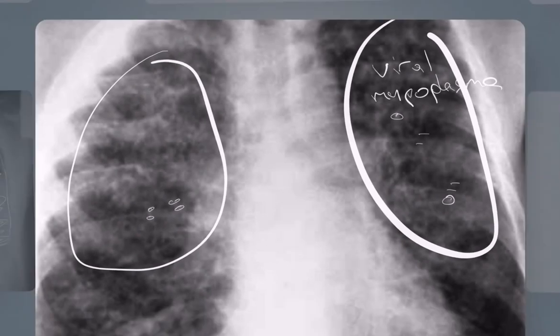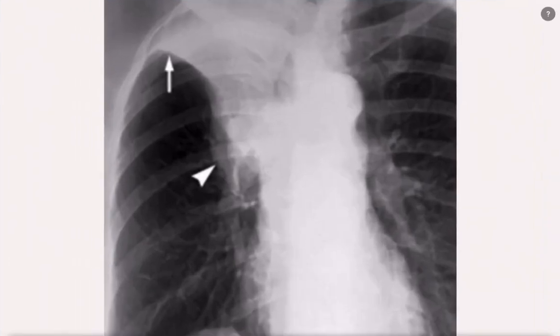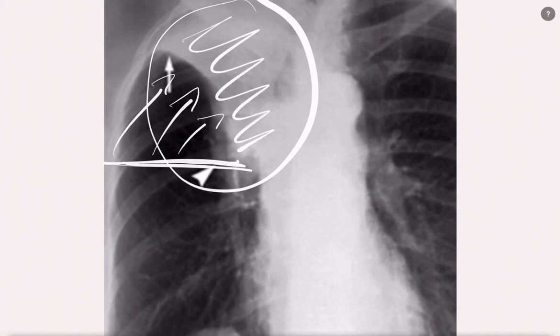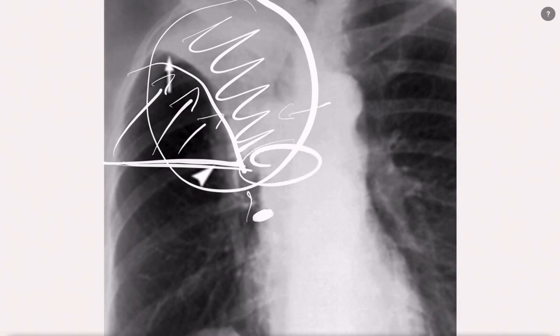Now let's do one more that comes up a lot, and this one is atelectasis. This is actually their upper lobe up here. Normally it should be somewhere down here, but it's lost volume and it's all been squished up. It's very densely white and it's got this little curve. So this person has actually collapsed their right upper lobe. This classically can occur in somebody who has inhaled something — a bean or something — a little kid who's got something stuck in their airway and then the airway collapses. This can occur in pneumonia as well, and can occur with a big tumor in here.